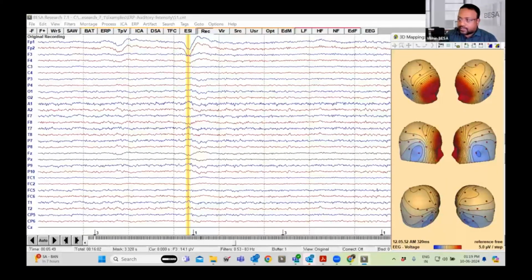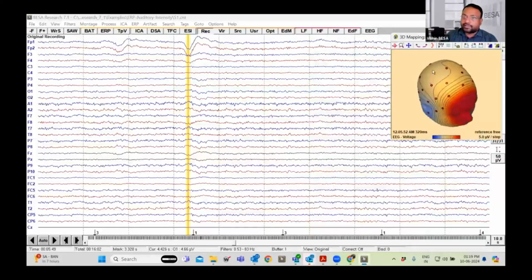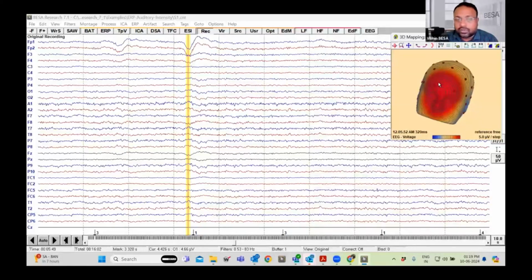You get 6 different views of the electric field distribution. Now, what I see here is a frontal positivity and a posterior negativity. Why do I get this? You see our eyes, the cornea and the retina, are basically polarized. The cornea is positively charged. At the same time, the retina is negatively biased.